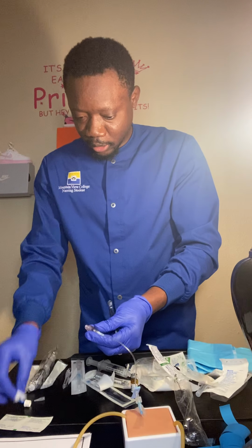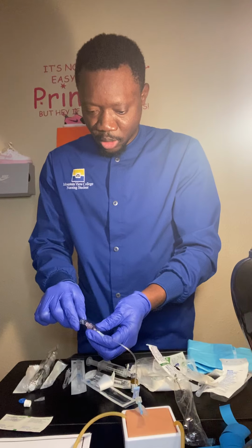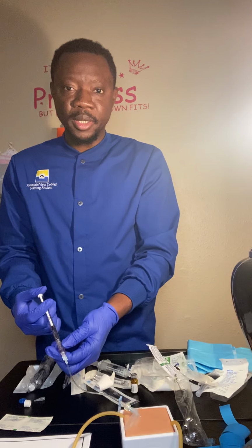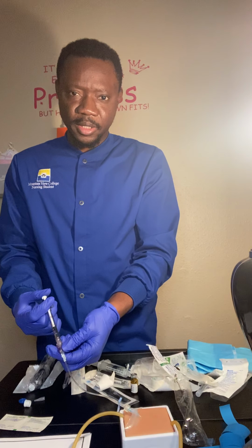Screw my saline. Then I clean it. Then I screw in my medication. Then slowly I make sure like 1 ml in 2 minutes. So as I'm pushing it in, I'm looking at the site and I'm looking at the patient, checking their tolerance.